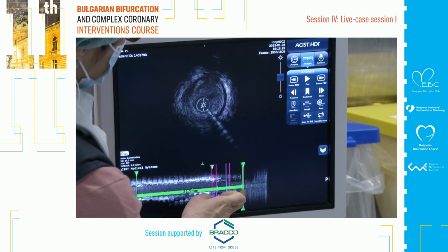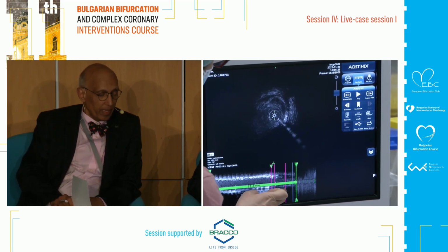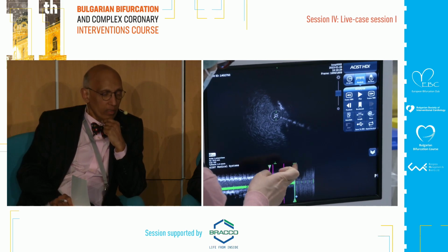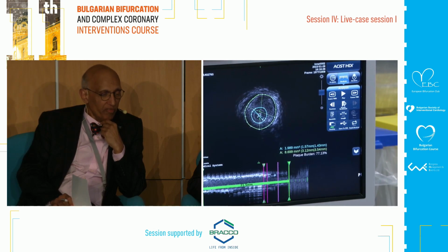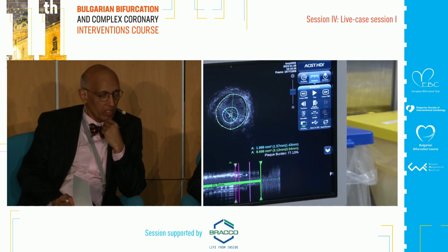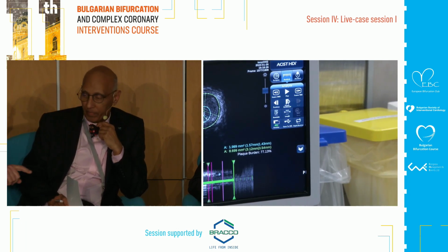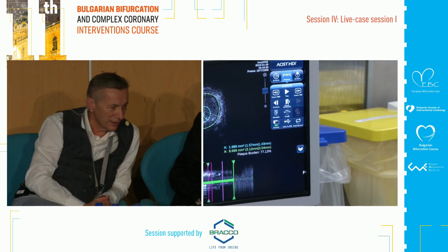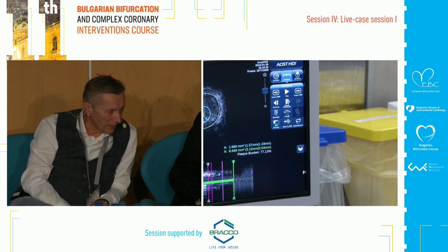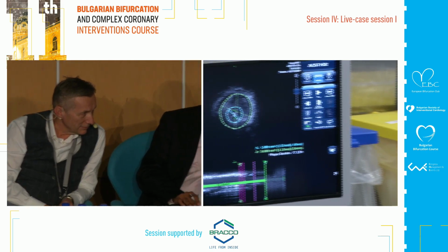Yeah, but you're making a very fine judgment, so you will have to get one strut maybe outside, and my fear is that you might possibly miss the lesion. I don't see the measurement. Lesion is 6. Six something. Akiko proposes an 8 millimeter stent. I will choose 12. Well, I will just say that it depends on what you will do to be sure that it's not moving.